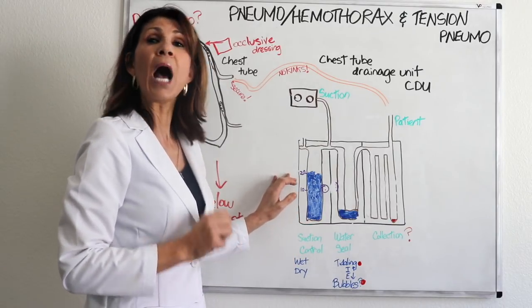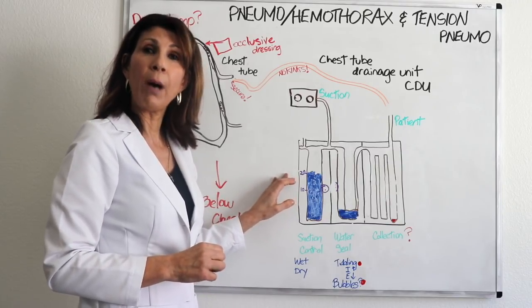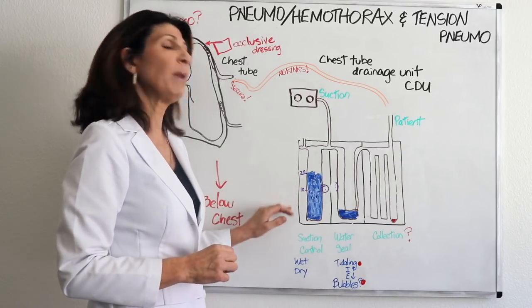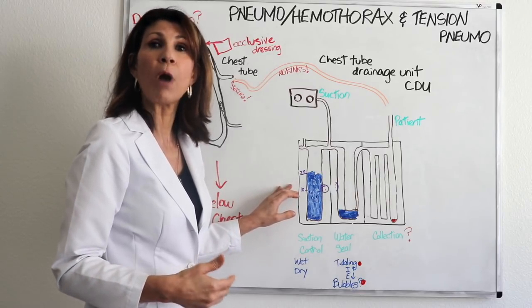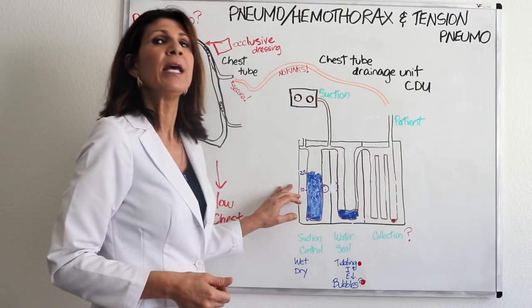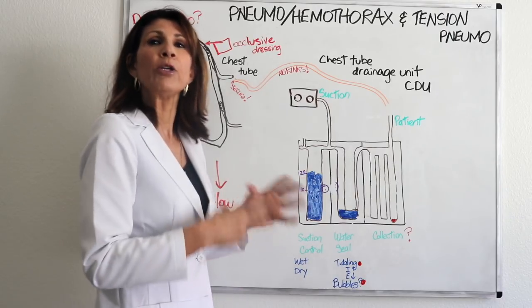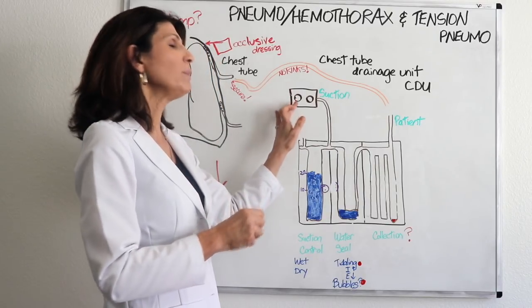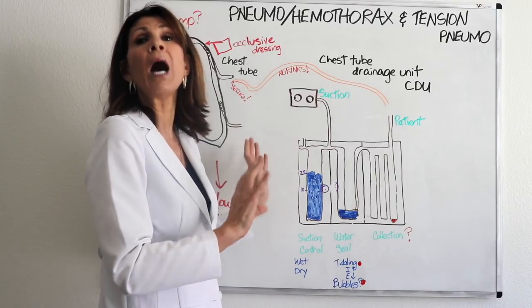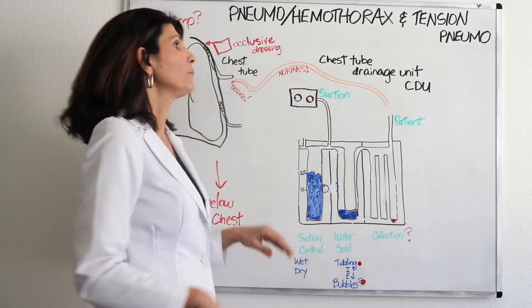With that being said, on the wet suction container, be sure that there are bubbles present, because if you don't see bubbles in the suction control chamber and suction is what's prescribed to allow for resolution, the patient is not getting any suction pressure. So the bubbles allow you to tell, oh yes, okay, suction is at the level it's supposed to be, it's turned on. Basically, it's an on-off measure. Bubbling on, no bubbling off.